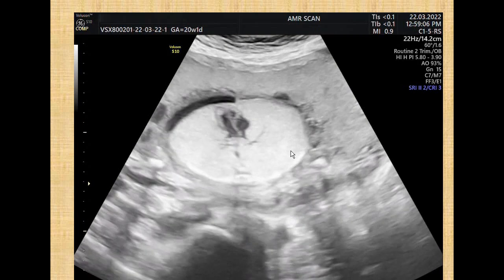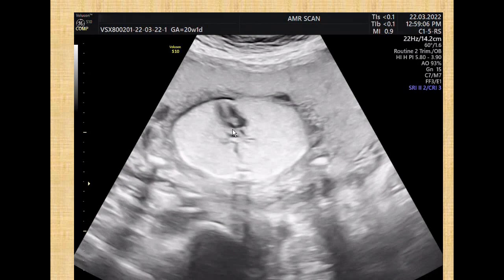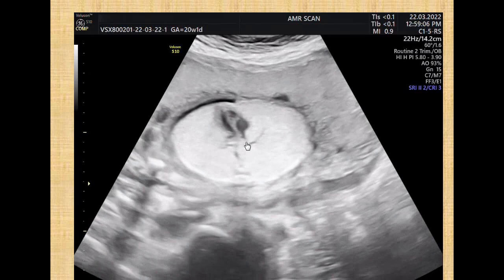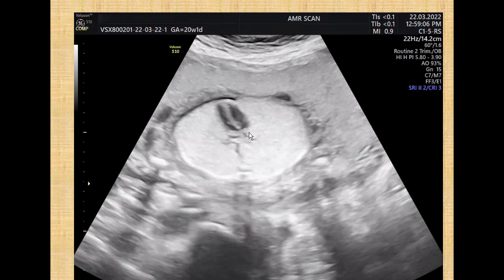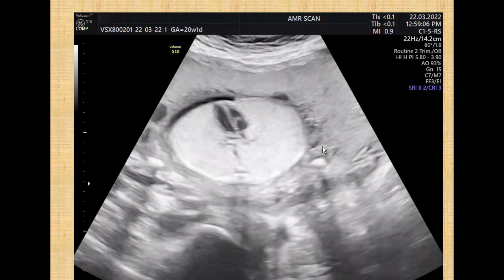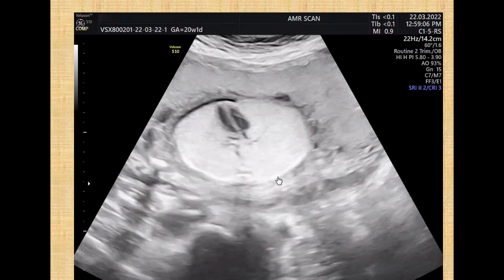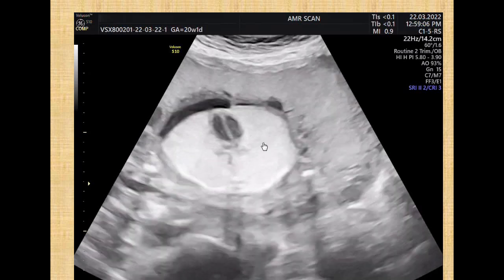Again, this video will show you hyperechogenic lungs. Mesocardia, with the cardiac axis rather deviated to the midline. And you will notice that the heart is markedly displaced anterior, as normally you will not see the heart displaced that much distance from the spine. Also, you will notice a fluid bronchogram, with bronchi beyond the heart seen filled with fluid, and the heart looks disproportionately smaller than the whole lung.